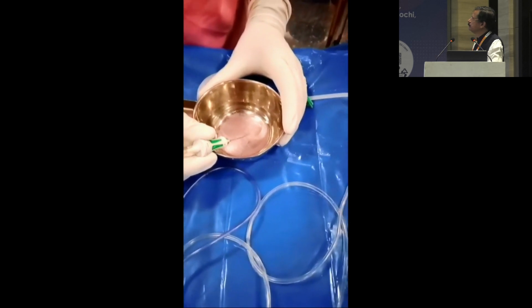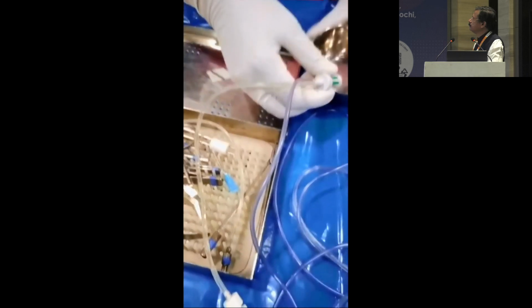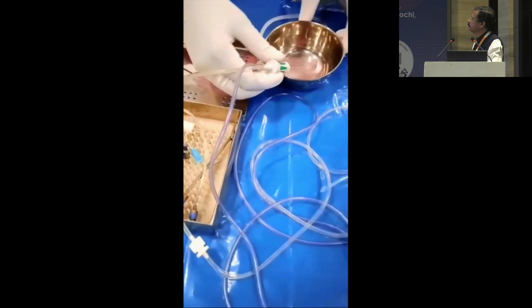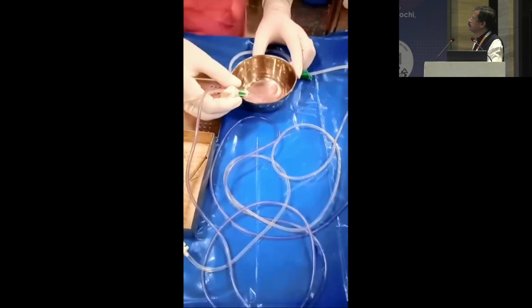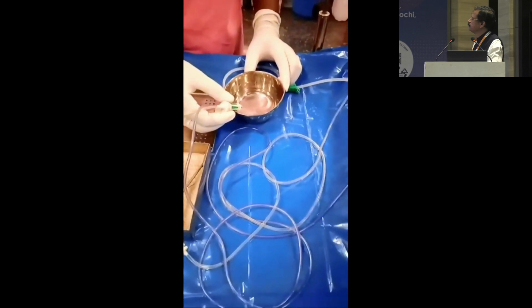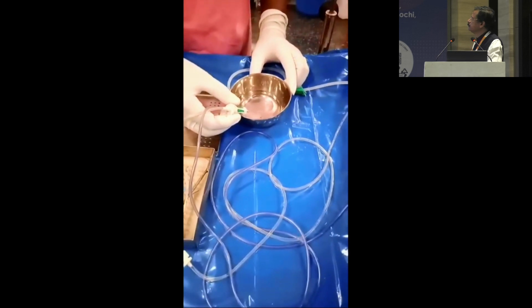So that would aspirate the fluid and also release any clog with the vitreous, viscoelastic or any cortical material. And also you should see the free flow of the BSS in the tubings. That would ensure that any clogging has been cleared.